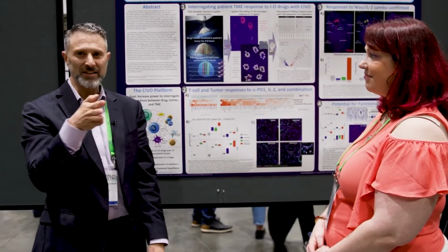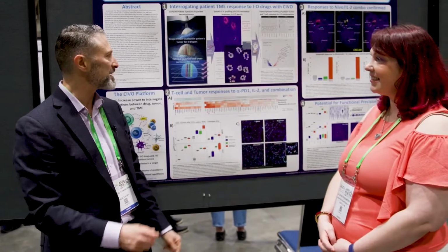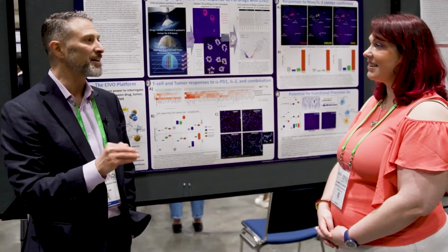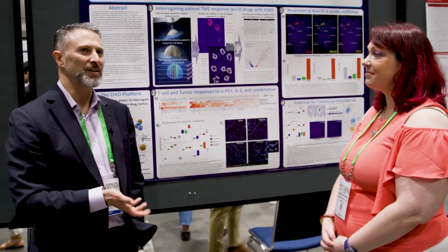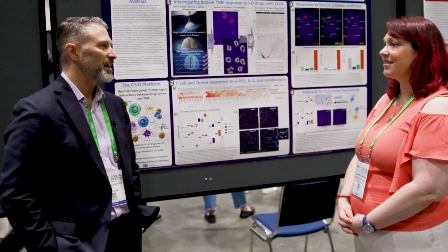What that creates is a gradient of drug from high to low. So in a sense, every site of drug microinjection can result in its own concentration response curve. So you don't need to look at different concentrations at different sites. We have set up our ROIs for DSP like that, and indeed, we absolutely get a dose-dependent response with R-squares that are quite unbelievable in some cases. I mean, 0.7 to 0.9, and so it's very, very accurate.